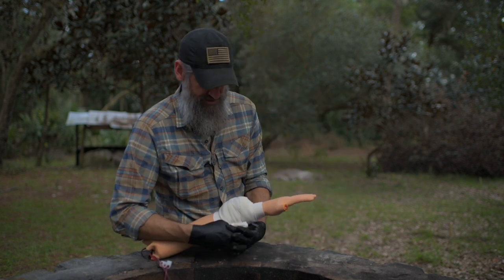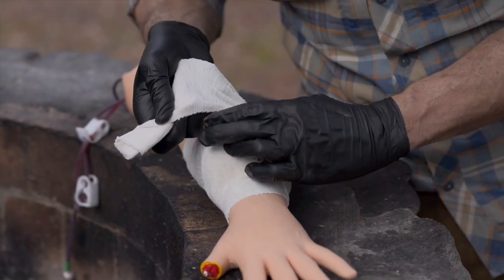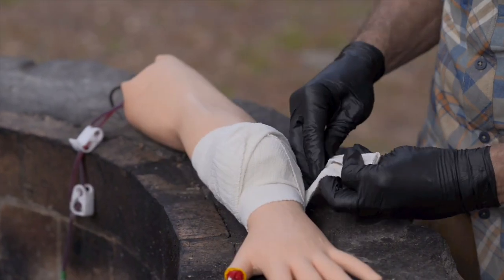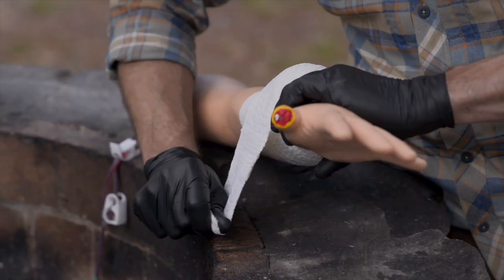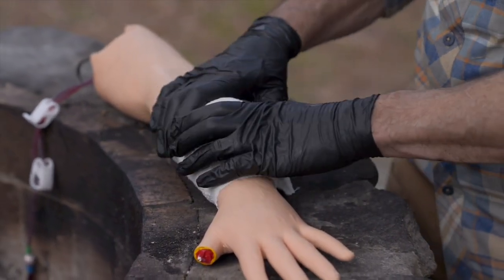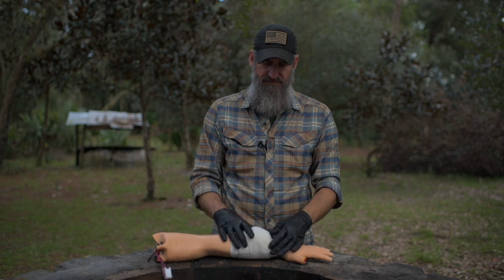I'll typically go over both edges after I do the hourglass over the top, and then when I come back over the top again, I'll go ahead and place another fold in there directly on top of the wound and continue out. Once I get to the end, instead of a clip on this particular one, I've got some Velcro. There are some that do have a clip on the end that you clip in, just like we did the Israeli. But again, check to make sure you still have a pulse, or check that capillary refill. So much the same, it's just a different way of doing the exact same thing.